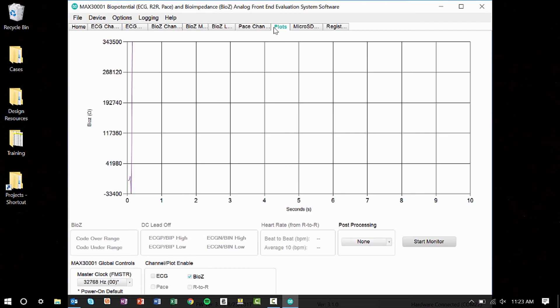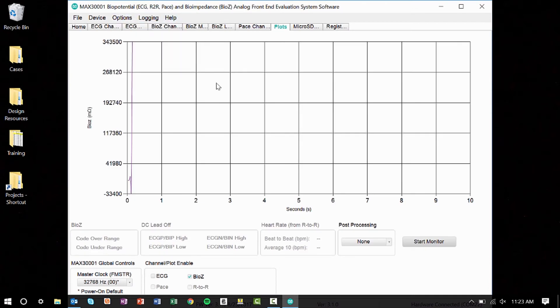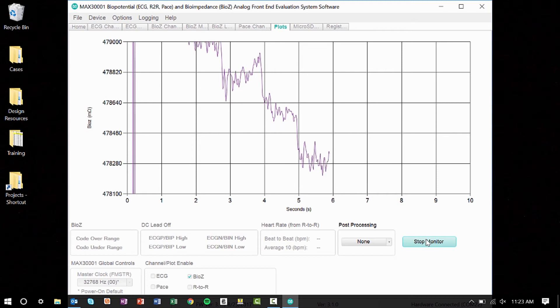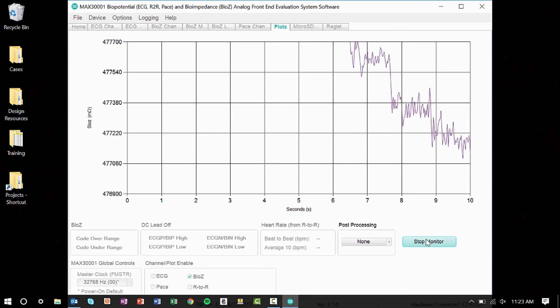Open the plots tab, click options, and check the BioZ milliohm scale, and then click start monitor. Once the plot settles and scales, you can see my bioimpedance in real time. You can actually see my heart rate due to blood perfusion, which causes small changes in impedance.